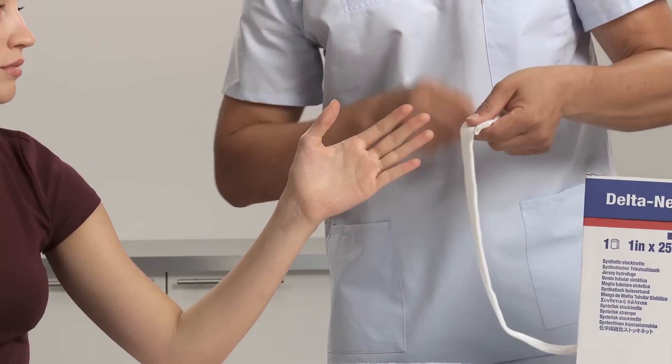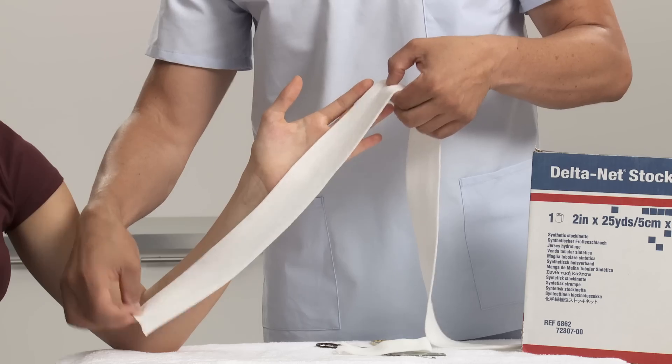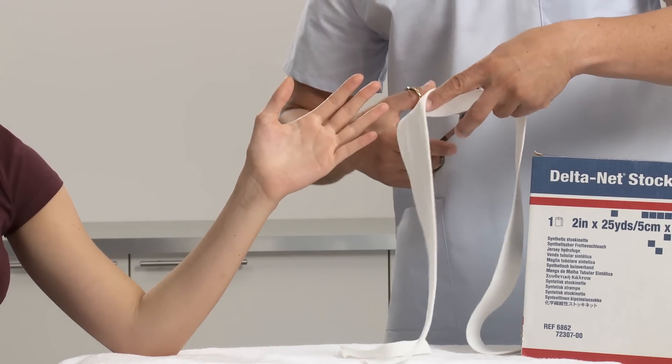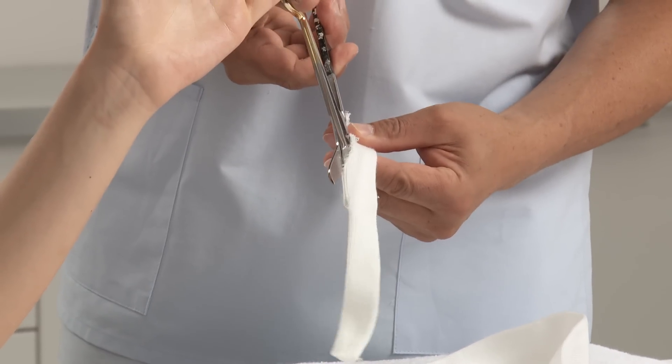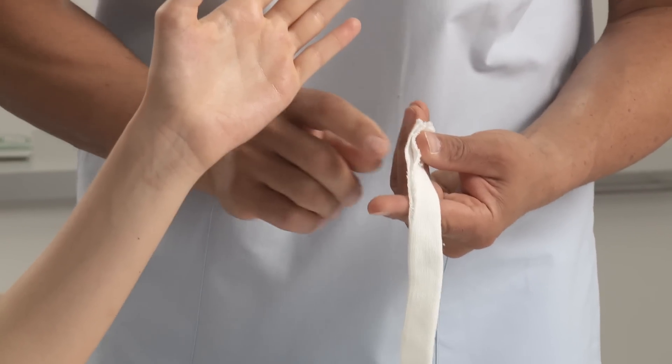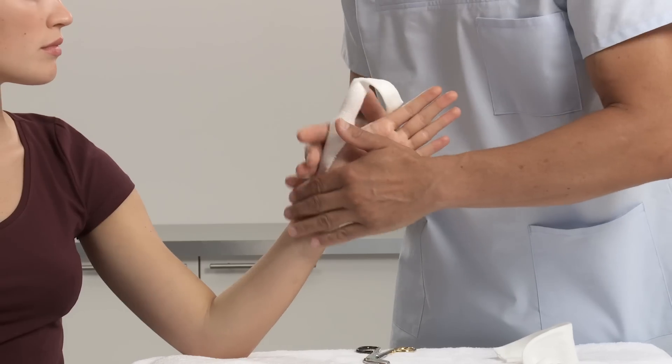Take a double thumb length of 2.5 cm or 1 inch width of stockinette and cut. Then choose the appropriate width of stockinette for the arm. Measure the length from elbow to the distal end of the fingers. Make a cut into the thumb stockinette and slide it over the thumb, smoothing it down.